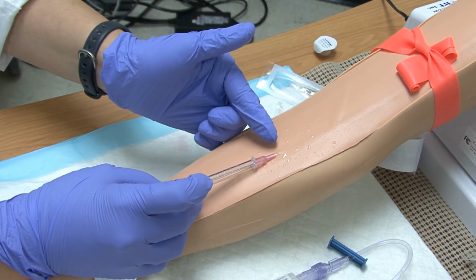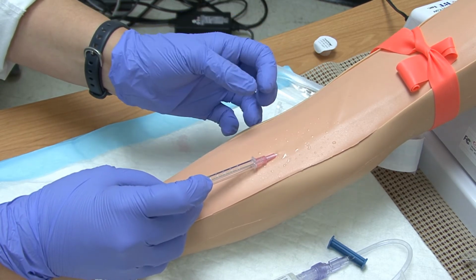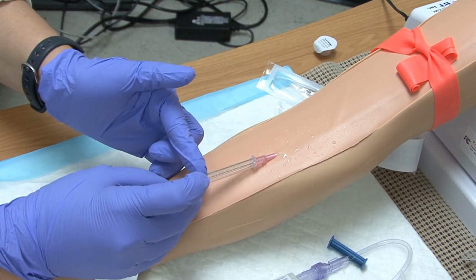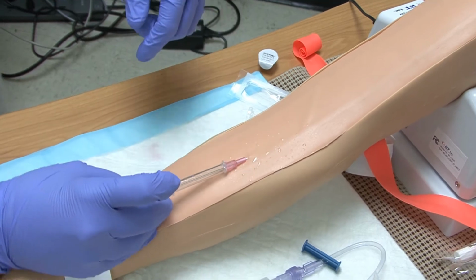If you do not keep the needle there, then it's like shoving a piece of plastic into your patient's arm without anything to guide it, and it's very painful, and you'll end up blowing the vein. At this point, the catheter is now there. The needle is locked because I've clicked it. I now need to come up here and let my tourniquet go without contaminating my extension set.